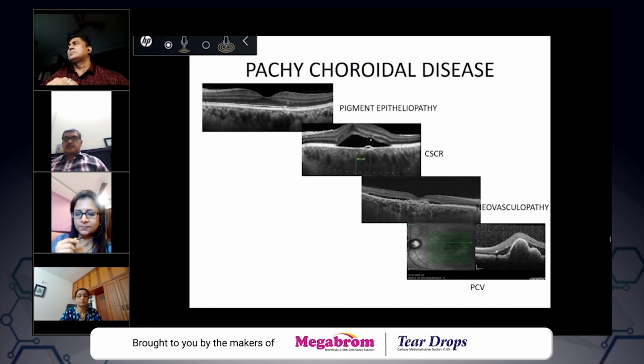Angiogram will give you typical fluorescein angiographic patterns, pinpoint leaks, and pooling of dye, and these patients will definitely undergo ICG also for us, because when you do an ICG angiogram, you will pick up these lesions. The number of lesions, these granulomas, is much more than what you see with the fluorescein angiogram. So the common uveitis case that we do go for angiogram is VKH.